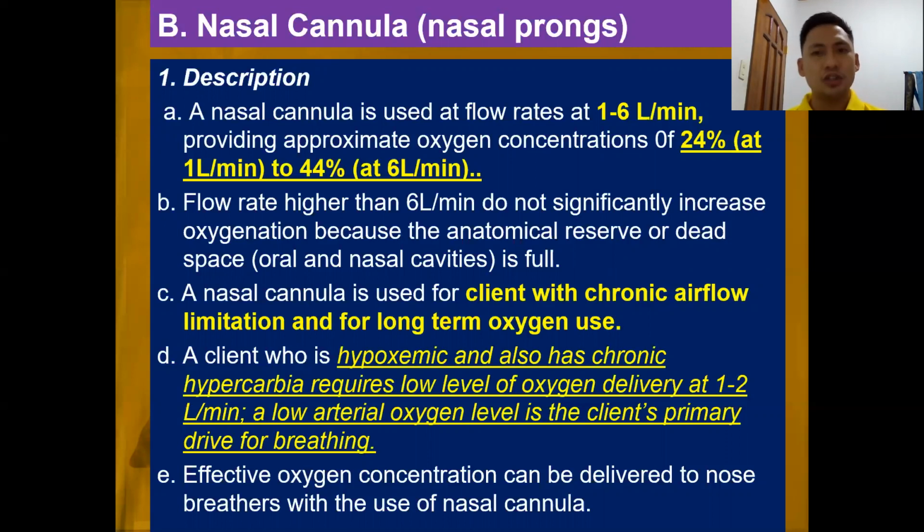So if you need to administer more than 6 liters per minute, then you will be advised to use other devices that could deliver a higher fraction of inspired oxygen.